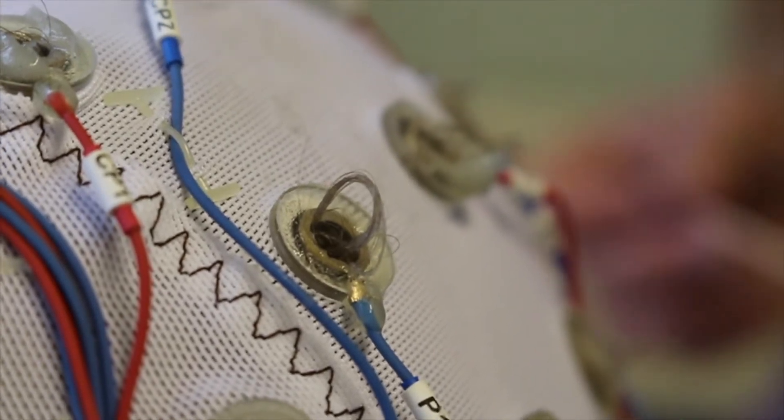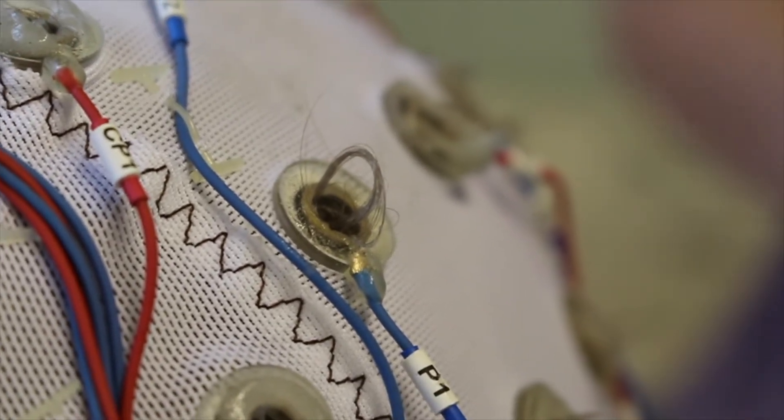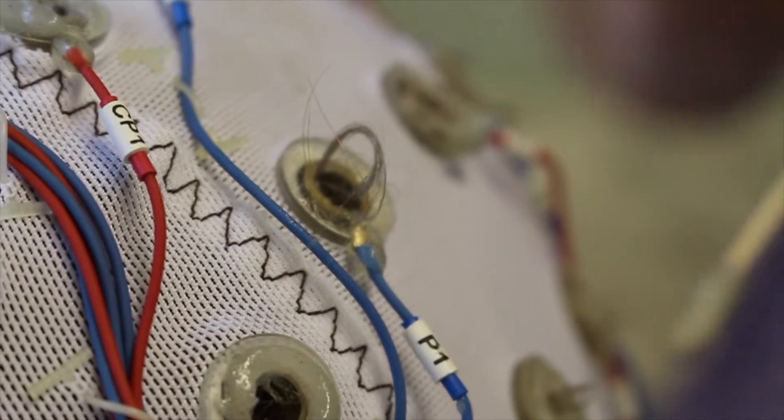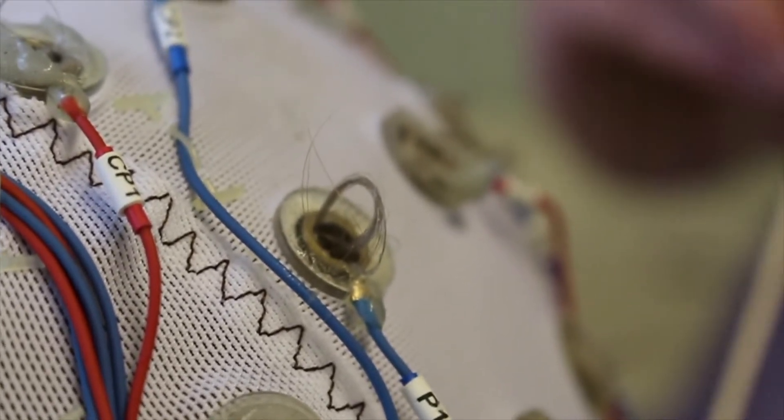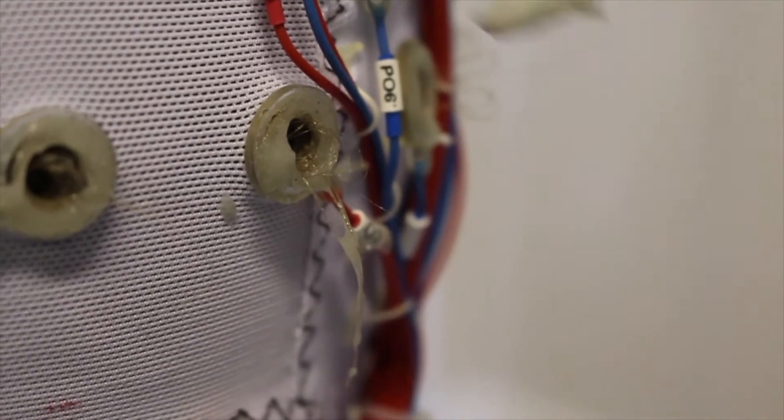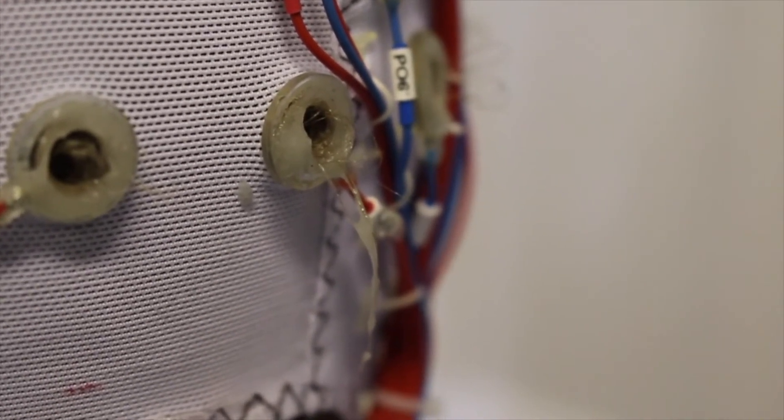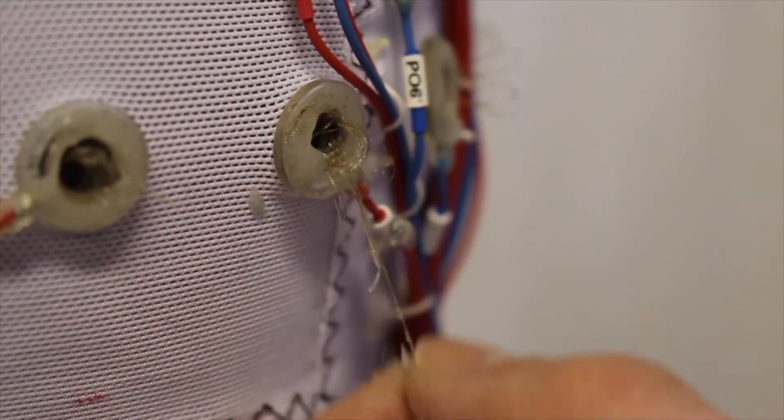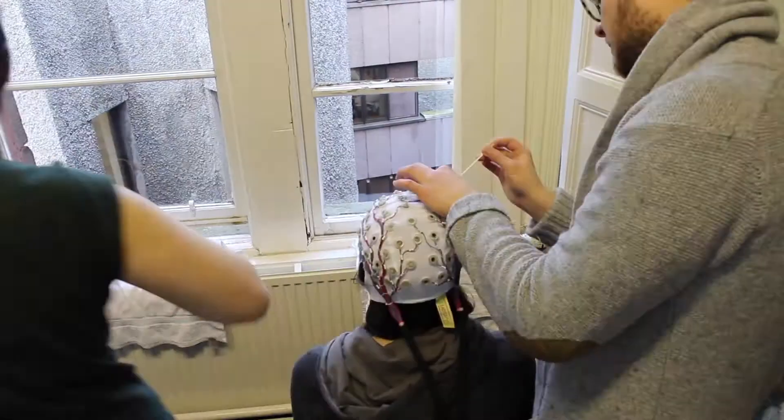Try to avoid pulling any hair out of the electrodes as this can cause bridging. This can happen easily if you're twisting the cotton bud on the scalp. To fix this, try to poke the hair back into the cap if possible. However, if any remain outside, try to remove any gel caught on the hair and keep it away from other electrodes.